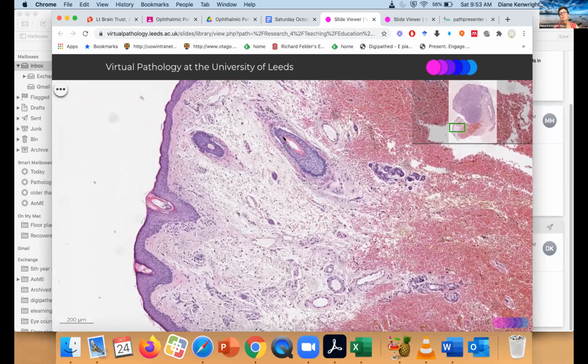Diane, how do you know it's not a lacrimal gland? How do I know this is not a lacrimal gland, the whole thing? No, those glands that you're pointing out. These ones? Yes, that's right. All right. So these glands here are full of lots of little tiny fat globules, right? And they're arranged in a lobular fashion around this expanded duct. So it is a kind of glandular arrangement, but it's the cell type that tells me it's not really, because of the sebaceous nature of these cells.